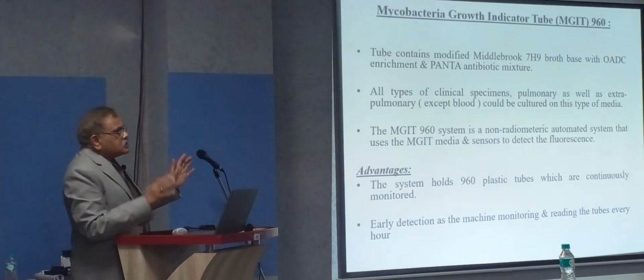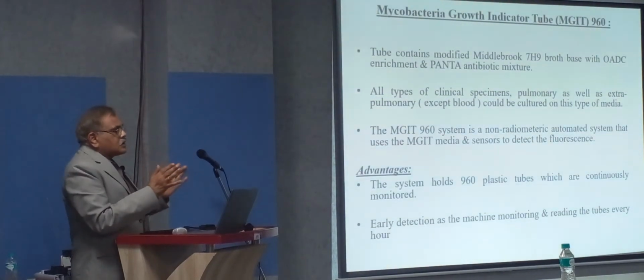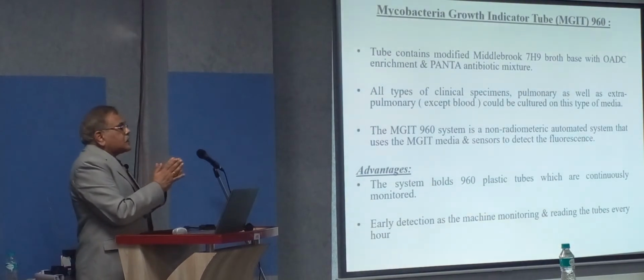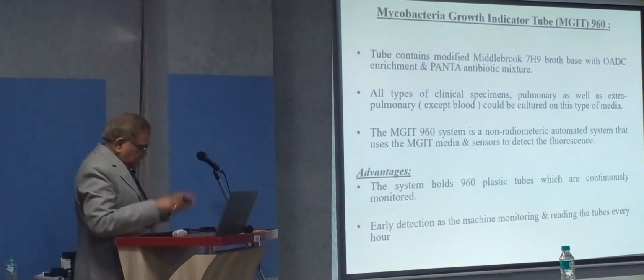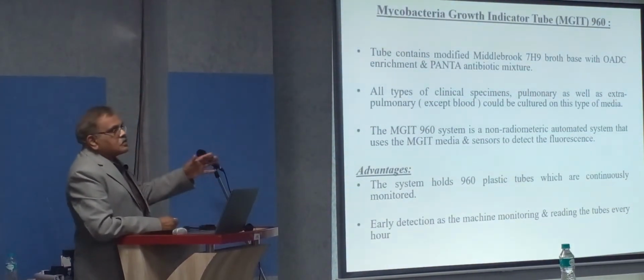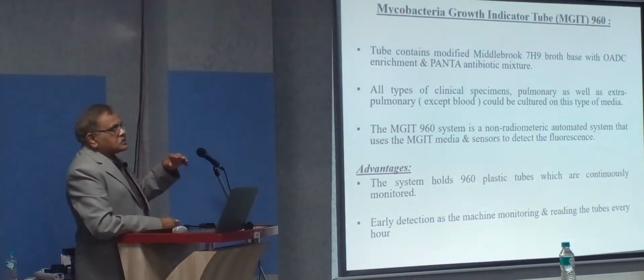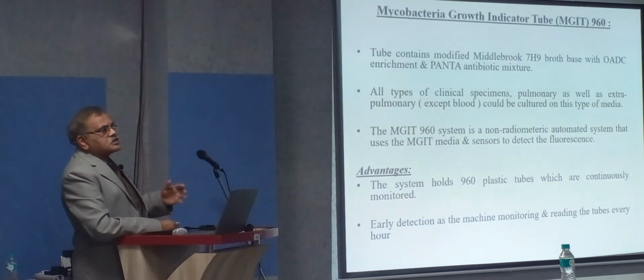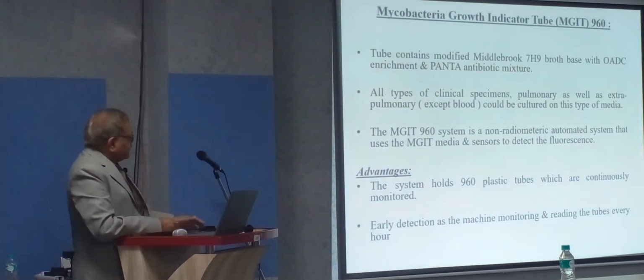So both decontamination and growth were done in the same tube. So there were chances of contamination, and all the reports were available within 2 months, less than 2 months, maybe 45 days.